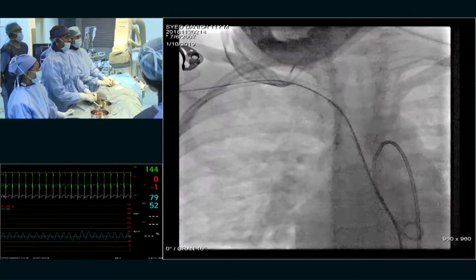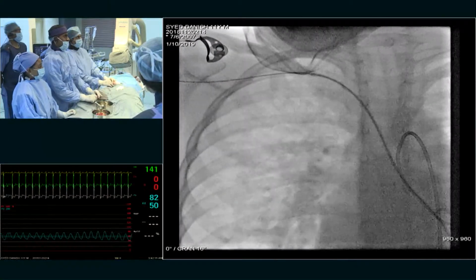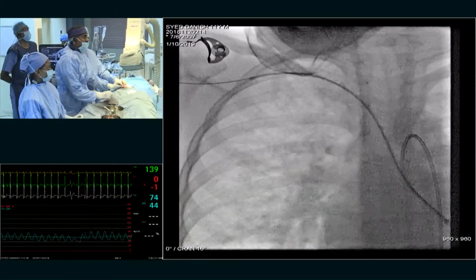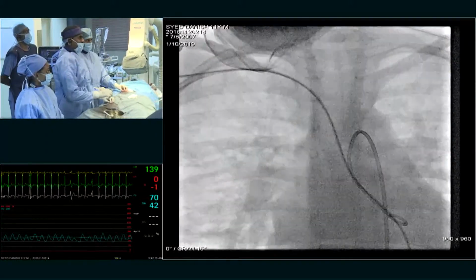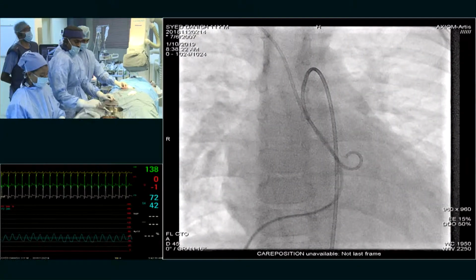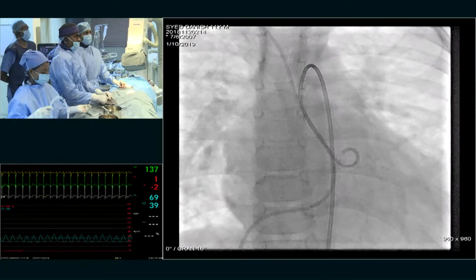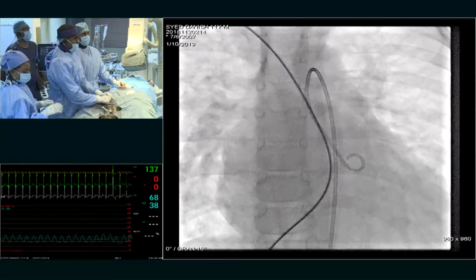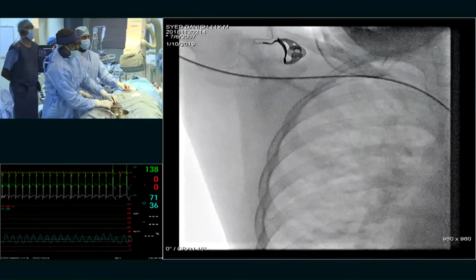So once I am into the subclavian, since it was an 8 millimeter AP window, you also saw that the pulmonary artery pressures were pretty high. So we are using a 12/10 PDA device. With the Qp:Qs of 4:1, we feel that the PDA device with only one disc on the aortic end and no disc on the pulmonary end will still not stand a chance of embolization, because we anticipate the pulmonary artery pressures to come down substantially.